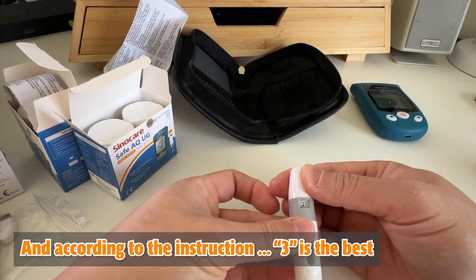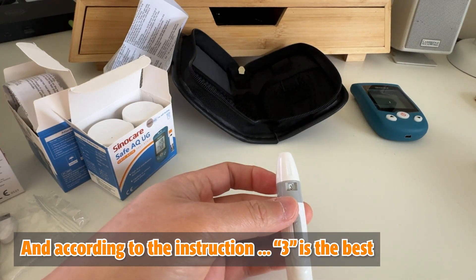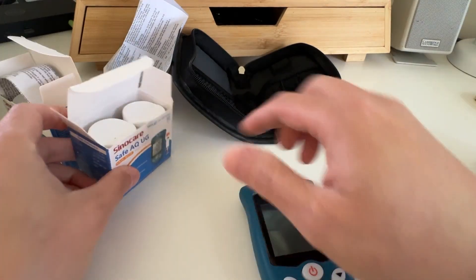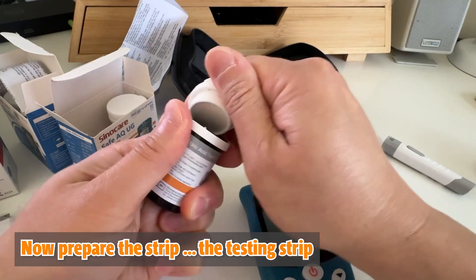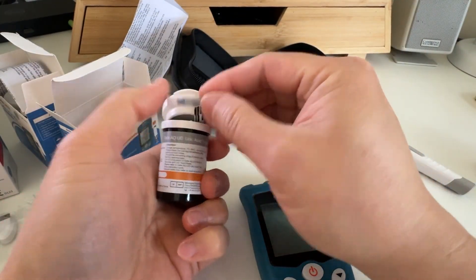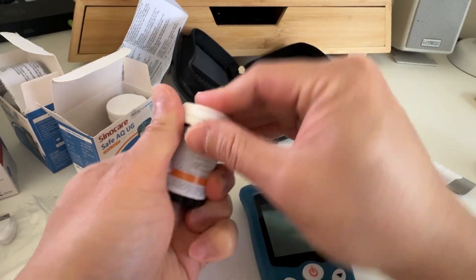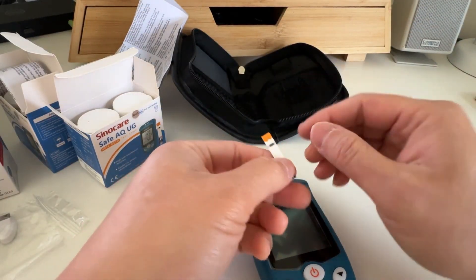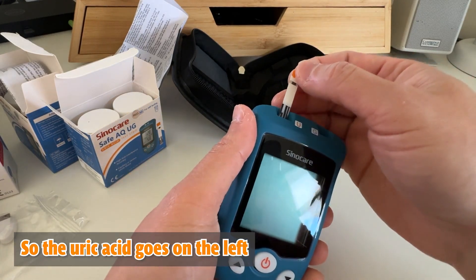Now let's prepare the lancing device. According to the instructions, depth setting three is the best. Now prepare the testing strip — the uric acid strip goes on the left.